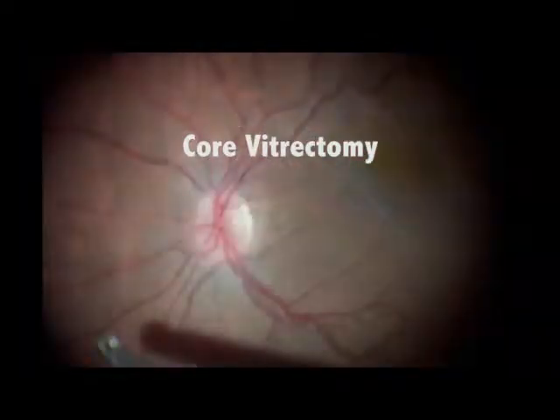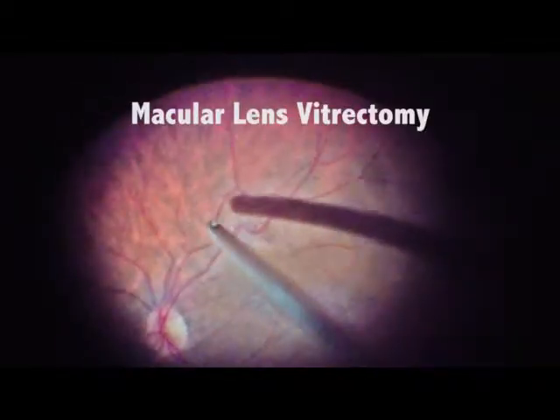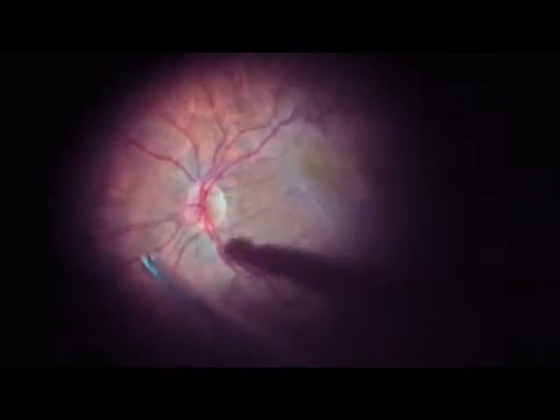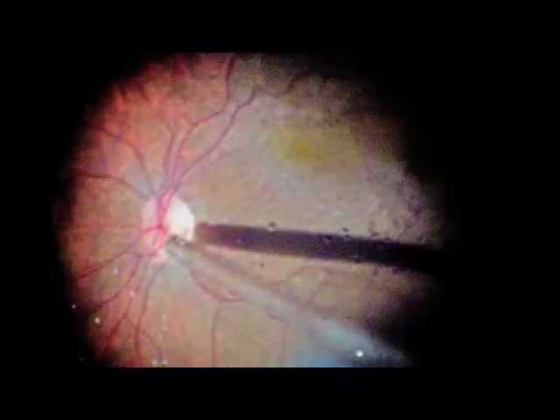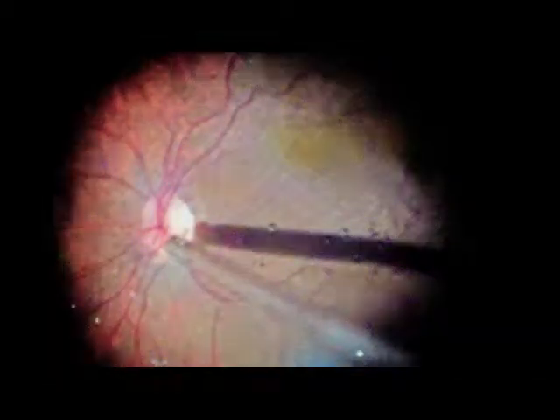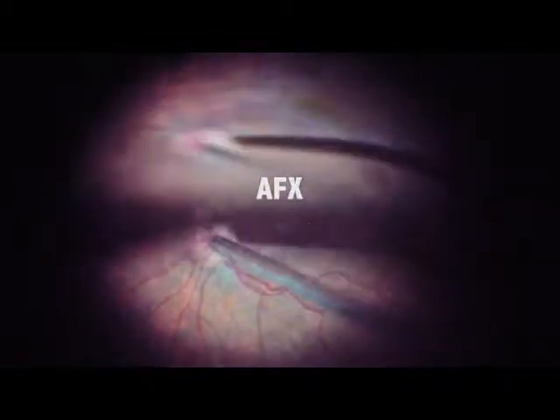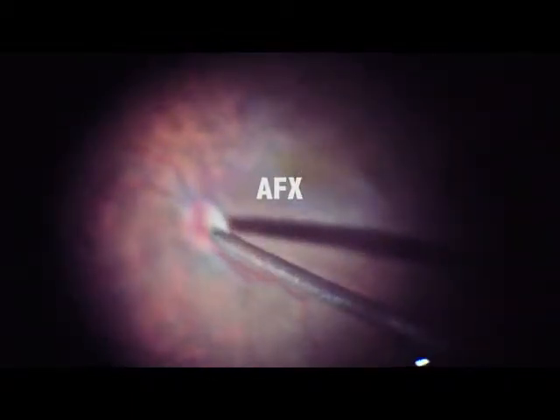We start with the core vitrectomy. We use both wide-angle non-macular lens and wide-angle macular lens — both contact lenses — for better resolution and a sharp view. An air-fluid exchange is performed afterwards for better staining from the brilliant blue, which comes in just now.